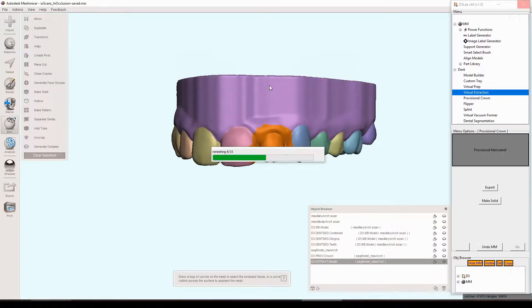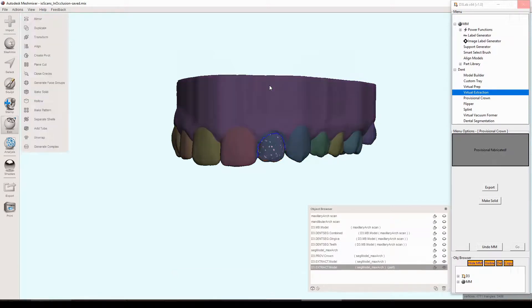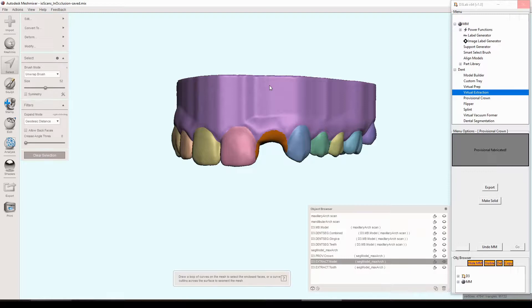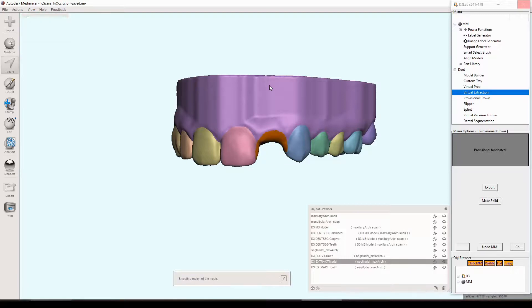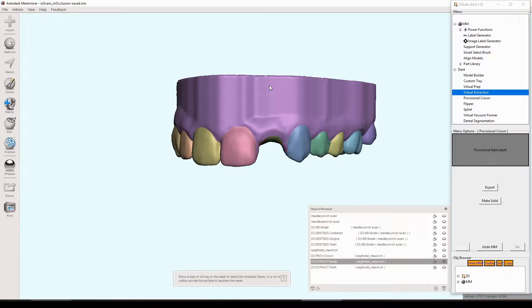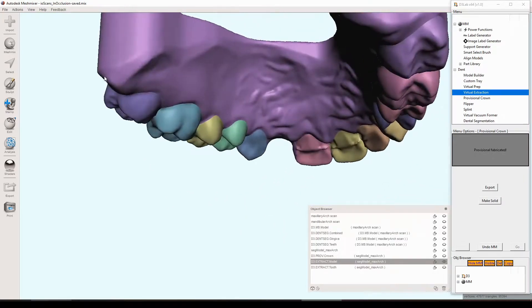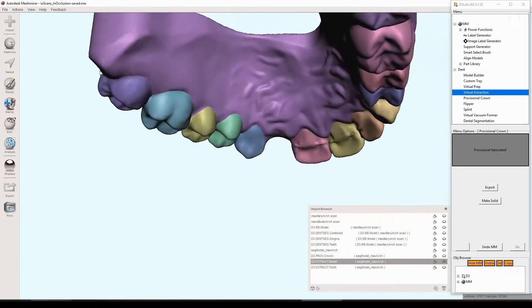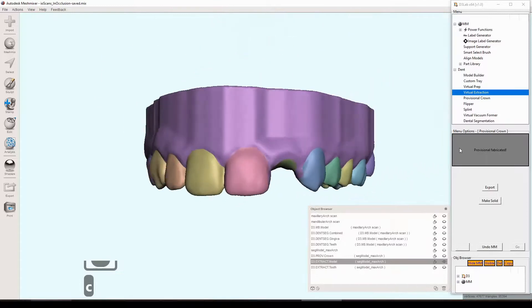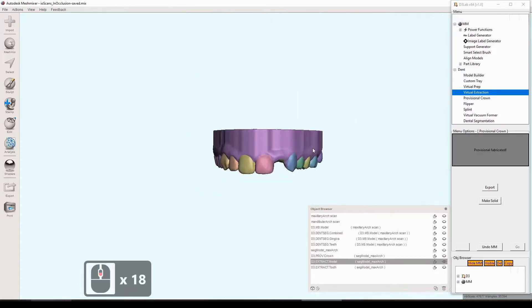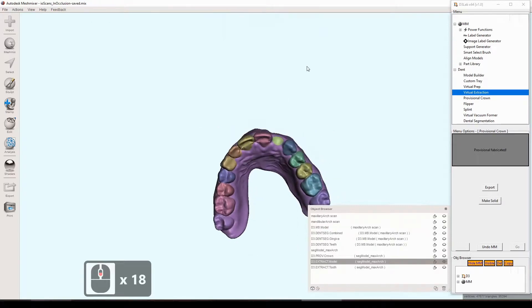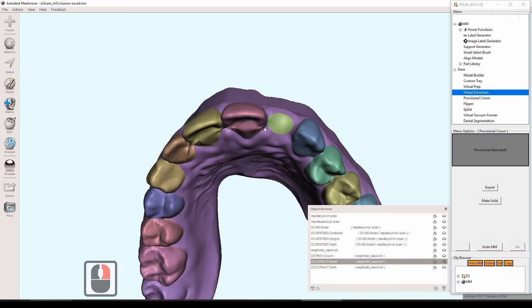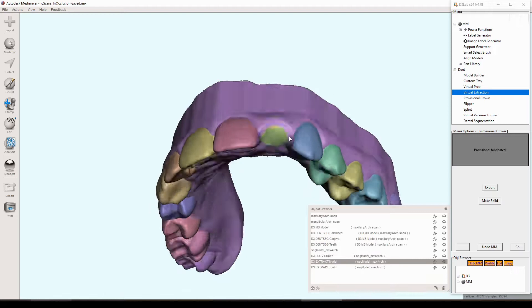And it only makes a copy of the model after you hit extract. You don't want all these duplicate copies. So only after you hit extract will it make the copy. And then it does a series of steps here to simulate an extraction while trying to maintain the best it can, the anatomy of the adjacent teeth. And also a little bit of trying to simulate what a healed socket would look like in the area to the best of its ability here. So I think it does a pretty good job. That's pretty nice.